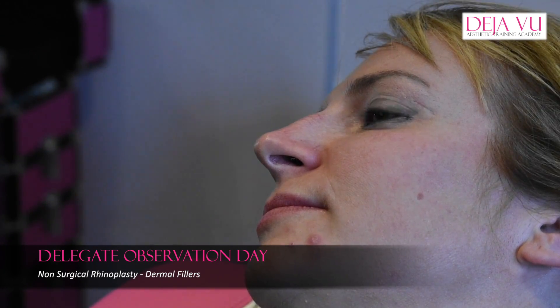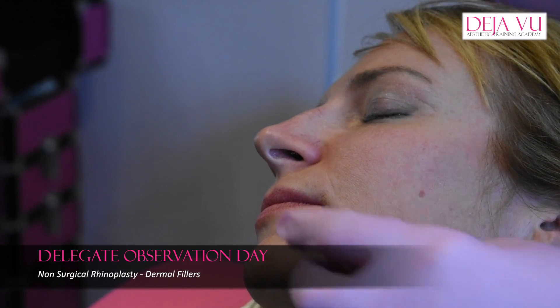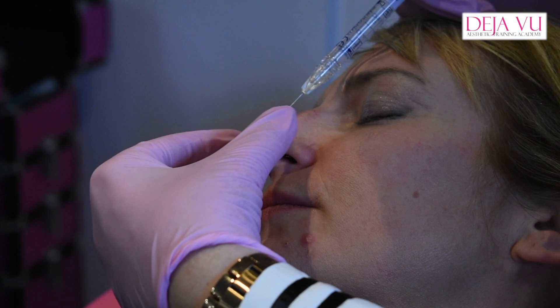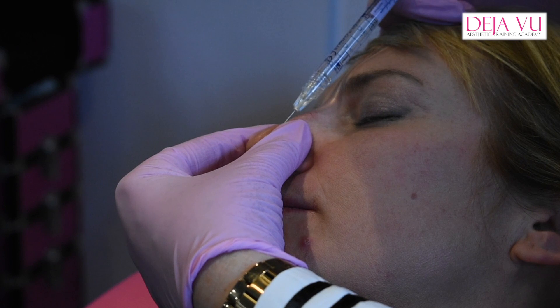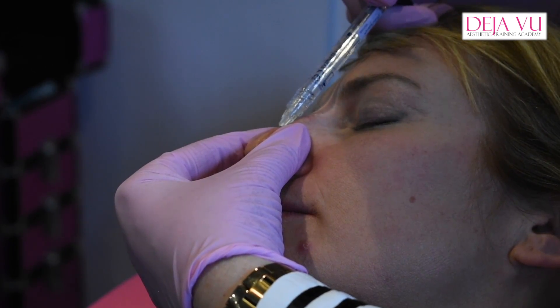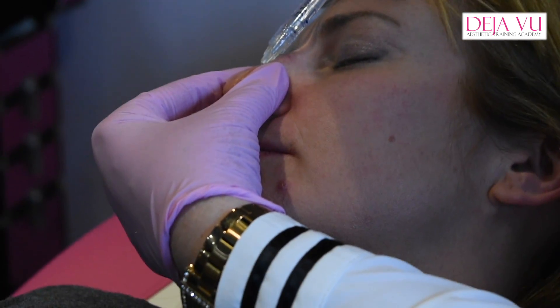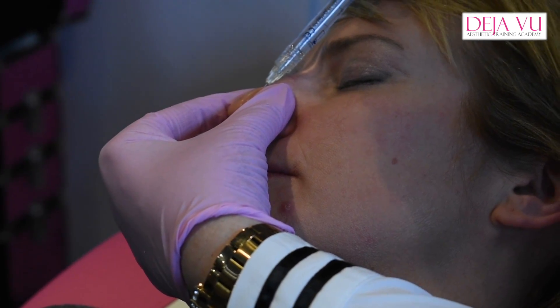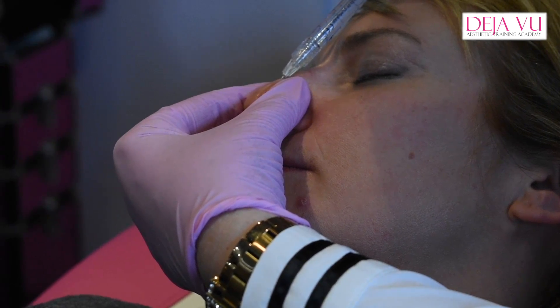This treatment is something that makes a world of difference to people. I'm going in from this angle, I'm going to squeeze the nose up to more or less how I want it. Going very gently and injecting very, very gently, very slowly. This won't take a whole syringe, so I can use it somewhere else if I need to.